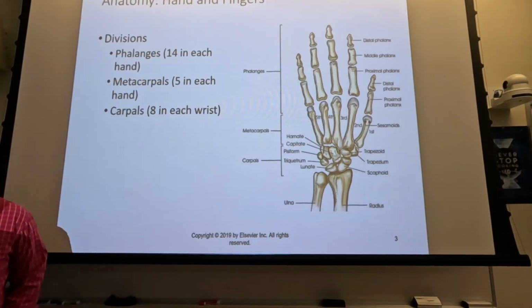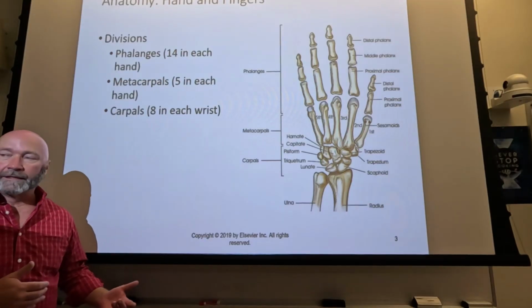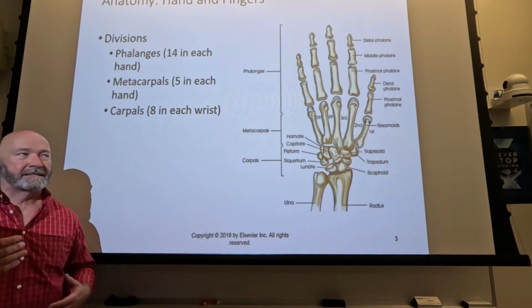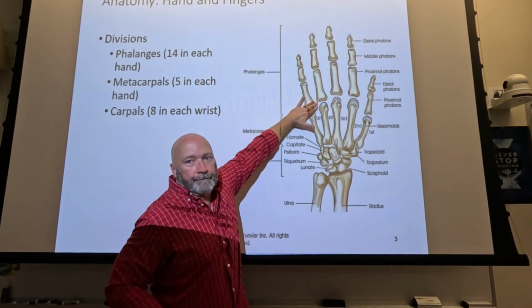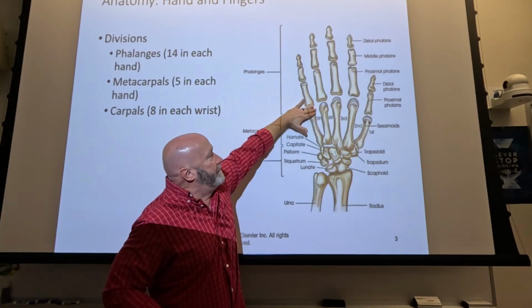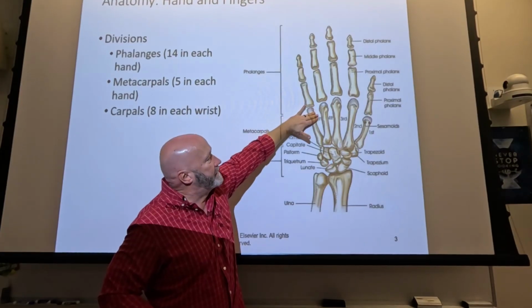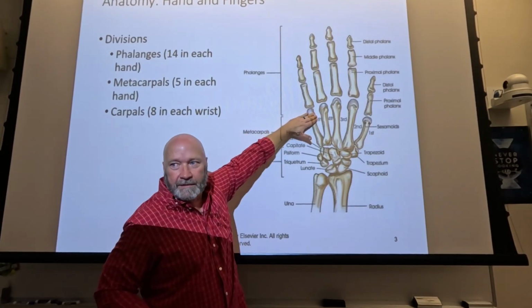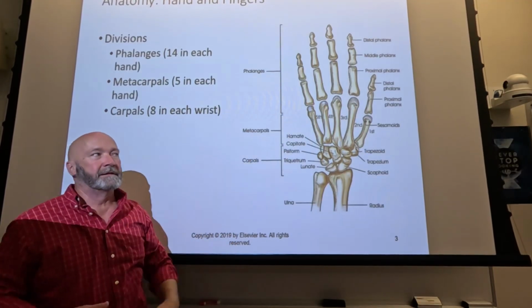And then you need to center your central ray to the middle of the anatomy that you're interested in shooting. So that's two things. The third thing is that you need to include adjacent anatomy. All right, so you can't say that I saw the entire finger if your collimation goes to there, right? You can't even say I saw all the anatomy if your collimation goes to the joint space. So you have to see the distal portion of the adjacent anatomy in order to make sure that you included everything that you needed to see.